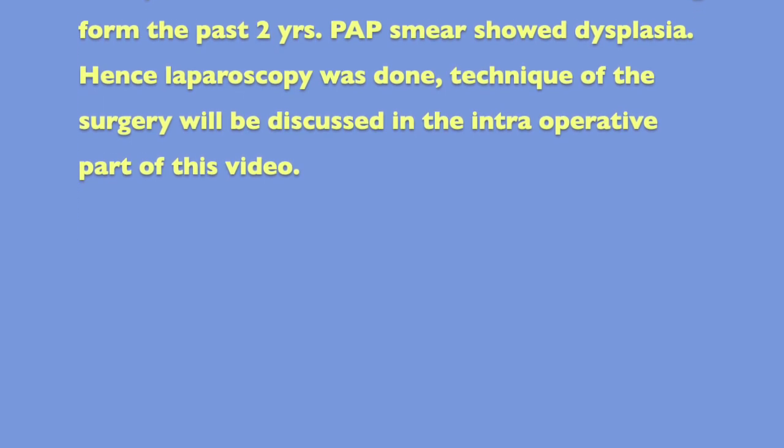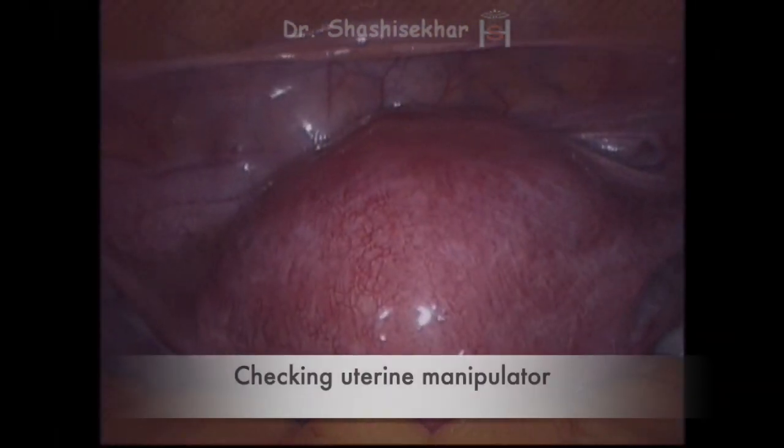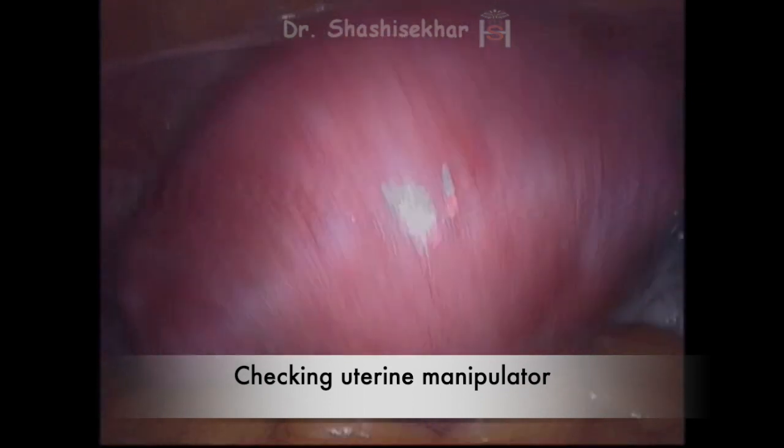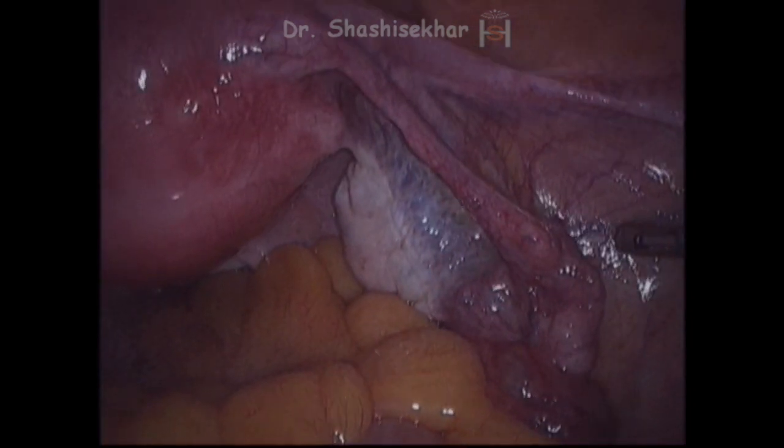A detailed description of the stepwise approach for laparoscopic hysterectomy is discussed in the video that follows. Inside the peritoneal cavity now, as you can see there are a little bit of flimsy adhesions which are being separated using the harmonic scalpel, probably because of prior tubectomy which the patient had long back. The last bit of adhesion is also separated now. In a hysterectomy the advantage is that you can put a uterine manipulator or colpotomizer which can change the direction of the uterus and facilitate the dissection of the adnexal structures.